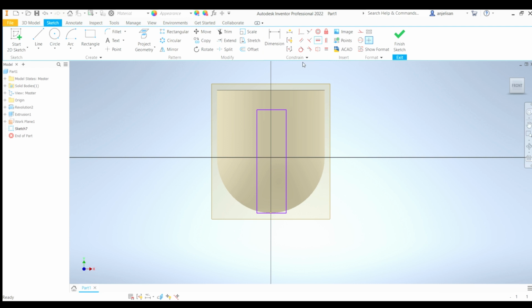Anyways, I want you to draw a rectangle. You can click any point on this, and again, we're not concerned about the width, but I think we should have this rectangle go down to the bottom of the cup. Okay, so this is awesome.